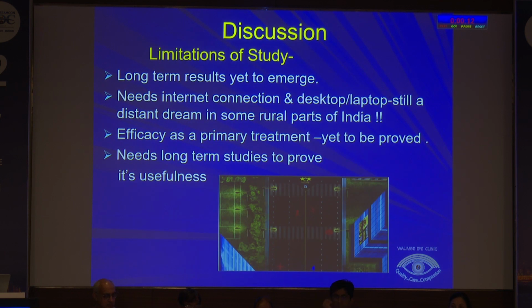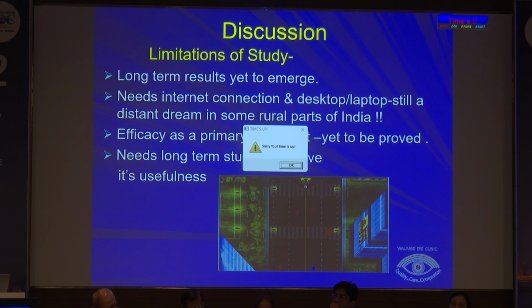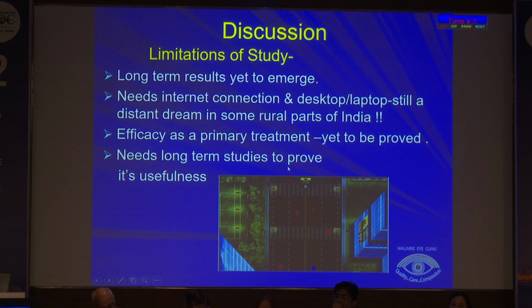But of course, there are limitations of the study. It is just a 4-month study, so the long-term results are yet to emerge. Of course, we are now having this conference in very hi-fi, with good internet connectivity and everything. But it does require an internet connection and a desktop or laptop. In some parts of India, having an internet connection and desktop is still a distant dream, so it cannot be universally accepted as of now.